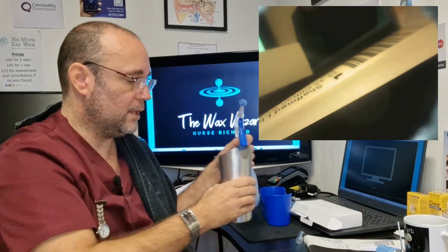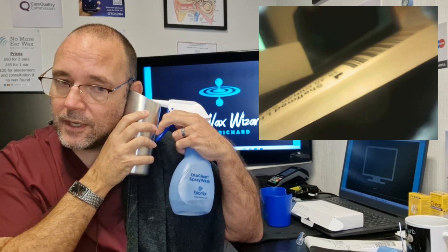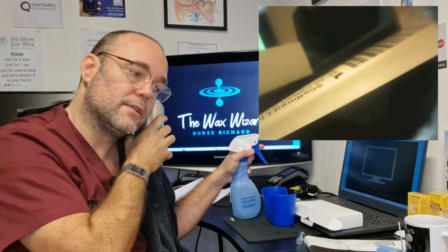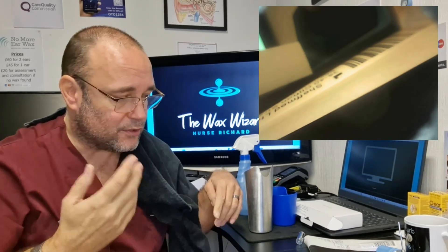I'm really not bothered if it doesn't come, not the end of the world. This edge is tapered as well, so you can't insert the nozzle too far - just like the way a specular is. Let's see if that's done the trick. Give it a dry and a scratch. The reason I do it when it's like that is it gets a bit itchy - it doesn't really affect my hearing too much, it just gets really itchy and irritable. Yeah, pretty much managed to get all of that debris.